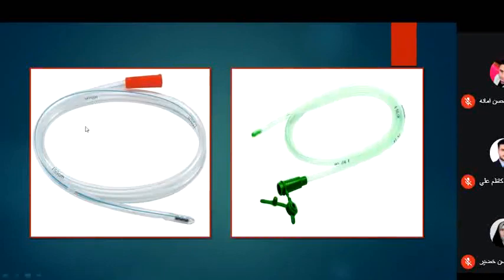So this is the adult size, and this is the neonate size. We should use the nasogastric tube starting from neonatal resuscitation, sometimes to make a decompression or a gastric washout, for a patient that took a lot of amniotic fluid.